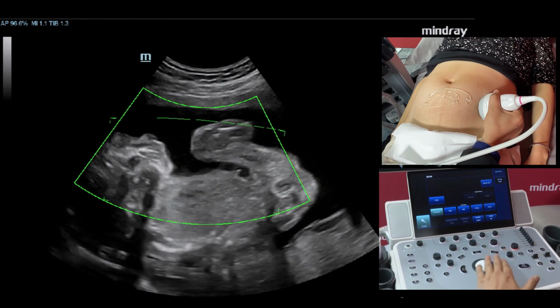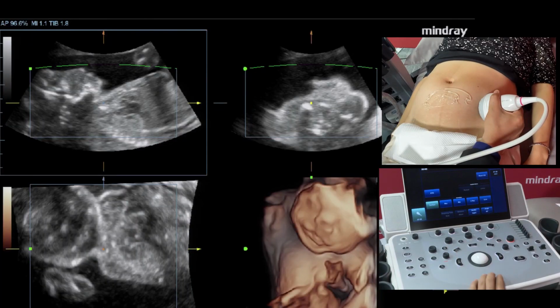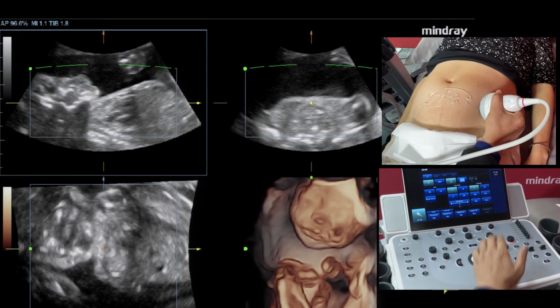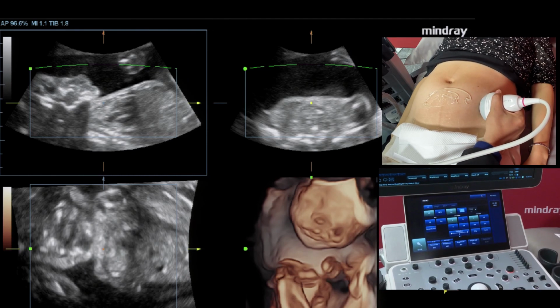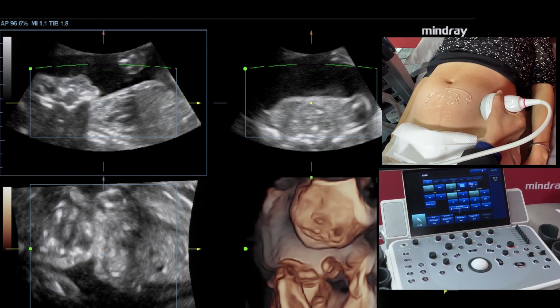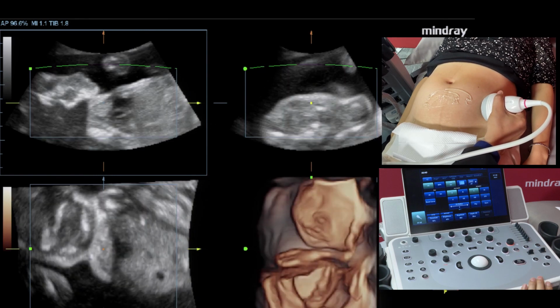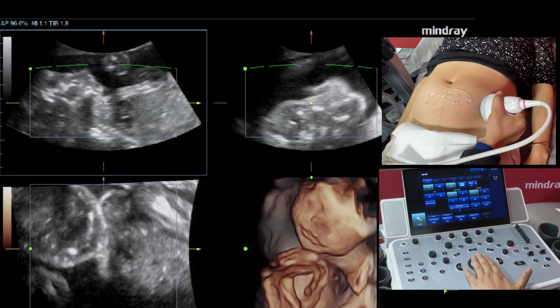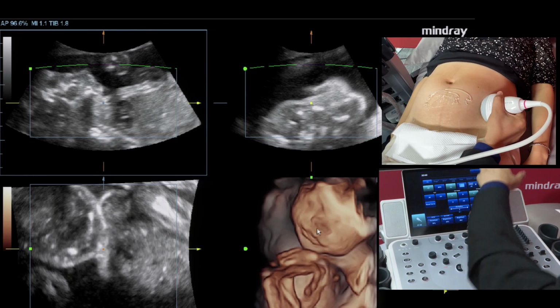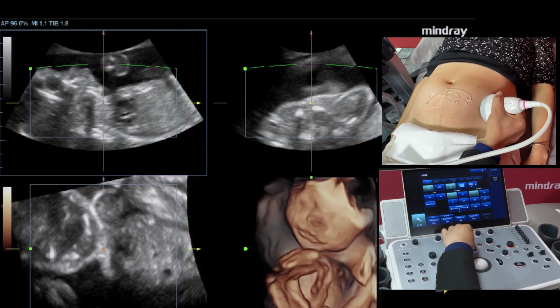And also we can try the 4D to see if we can capture one moment. Oh, you see here, this one is good. So for this case, if the position of the baby face is not good, I think sometimes it will be helpful to use 4D to capture. So you see when I freeze it and save first, and then I can move the trackball. You can see for this moment, the baby face is much better. The lips, the nose, and also we can change the y-axis, x-axis, and the z-axis.